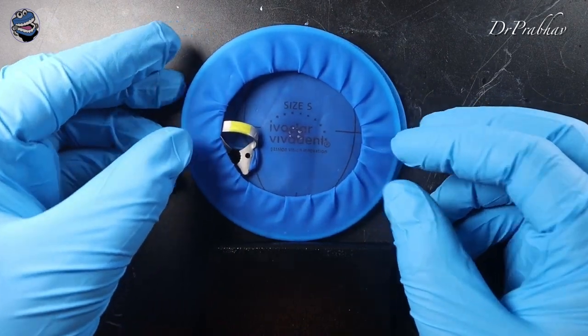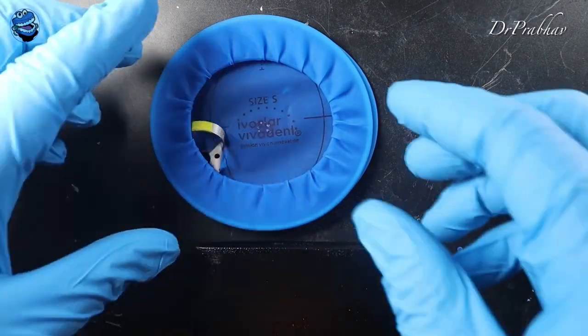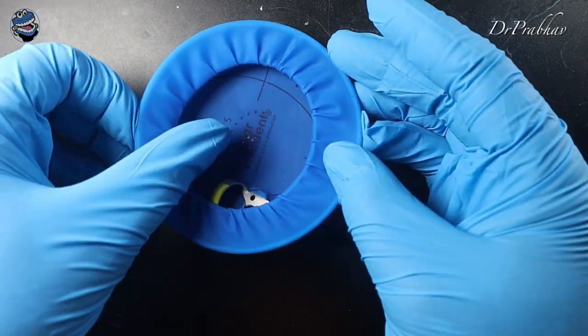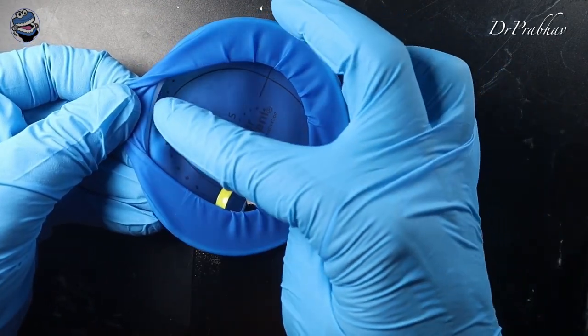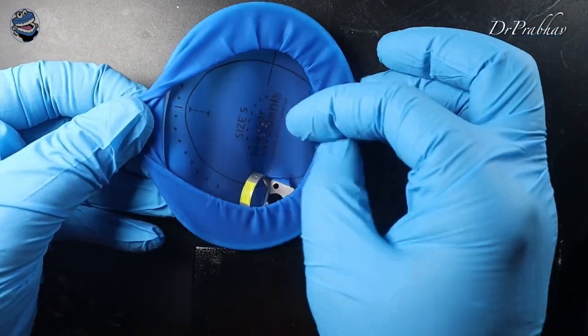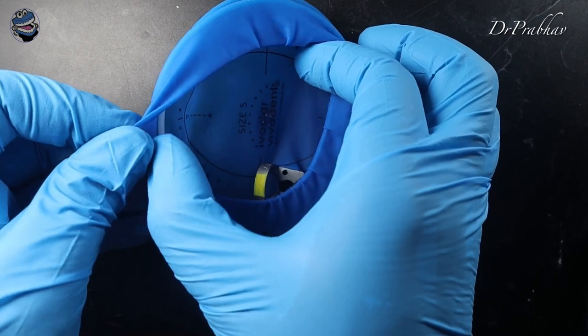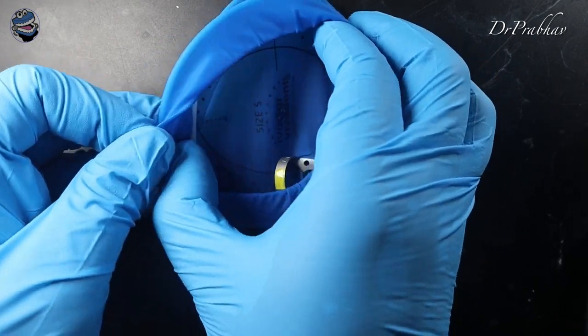Now our unit is ready. As we can see, the clamp is ready and our complete rubber dam set is ready. This OptraDam is now ready.